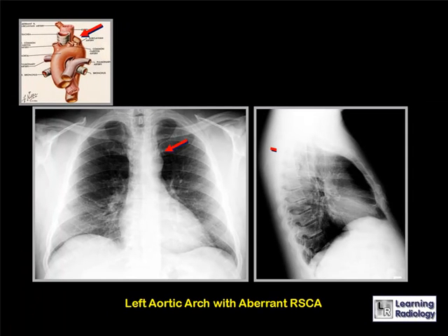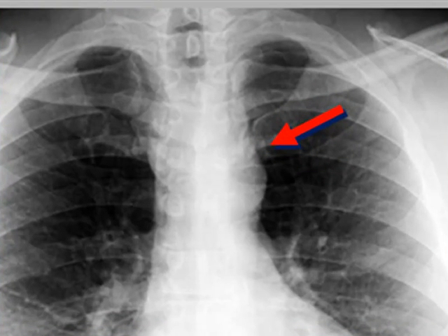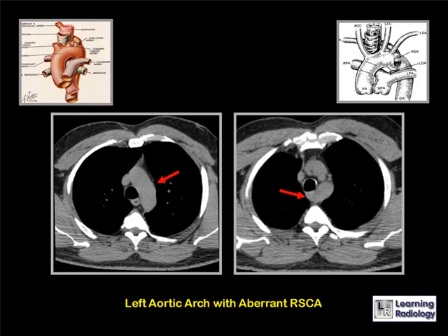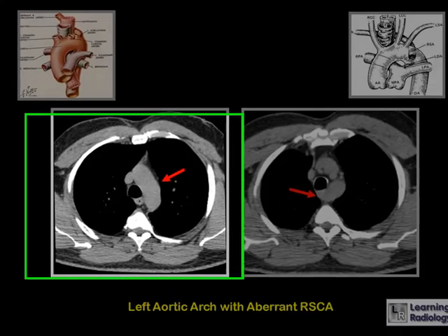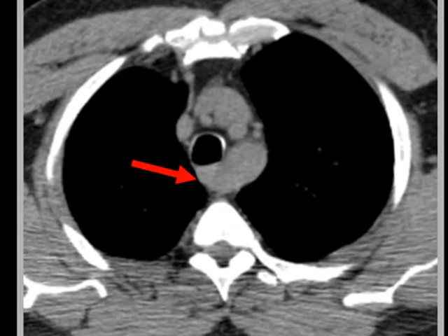This is what a left aortic arch with an aberrant right subclavian artery can look like. On a frontal chest examination, the red arrow is pointing to the oblique shadow just superior to the aortic knob. On the lateral view, the trachea and esophagus will be displaced forward. On CT scan, you can see the aberrant right subclavian artery passing posterior to the air in the trachea and pushing it forward.